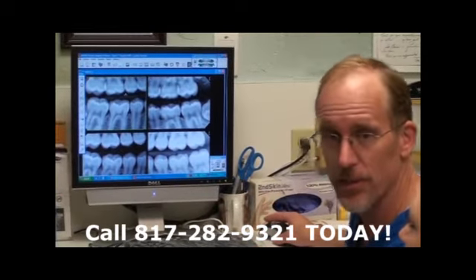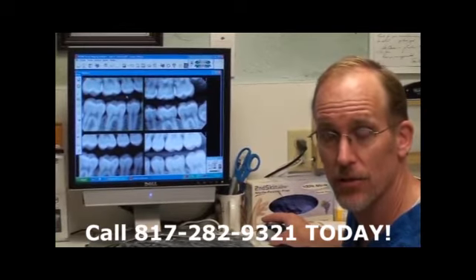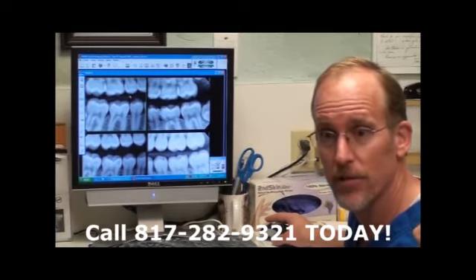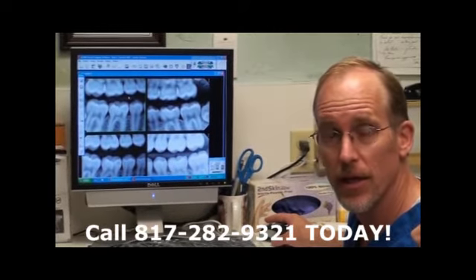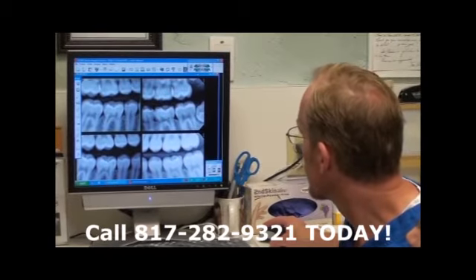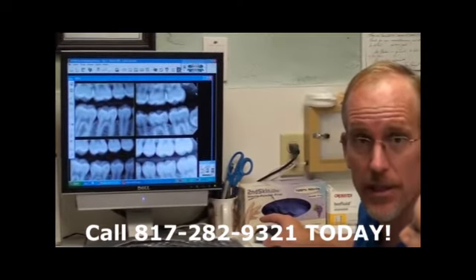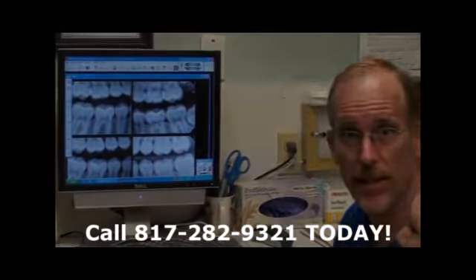So that's what digital radiography does. It allows you to be a good diagnostician through good technology, and it lets you give better treatment to your patient. That way your patient feels more secure about what is being told to them, and is given good treatment. So that's what technology in dentistry is doing today. Now I'm going to take a look in the mouth and see if what we see on the x-ray is similar to what we see in the mouth.